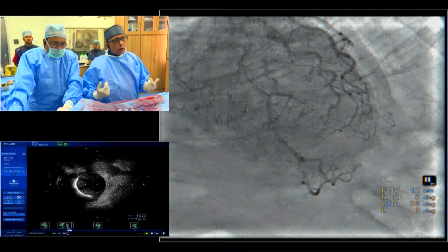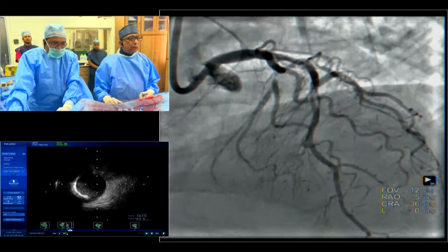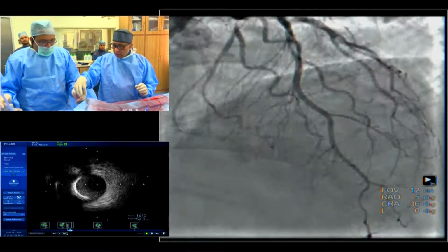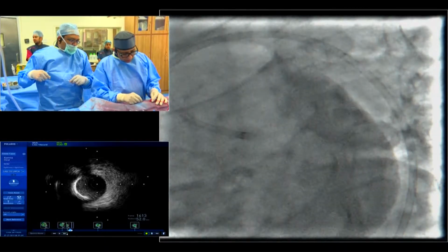Yeah, if I do not have access to rota, absolutely. If I do not have access to rota, I would have gone for a cutting balloon. Okay. Your strategy is, we are actually going towards a rotational atherectomy. Shuvanan, your strategy is stenting up to the ostial LAD because the LMCA is totally free of disease, right?